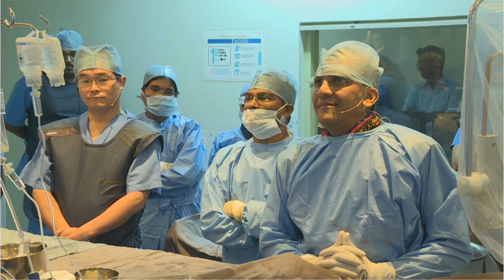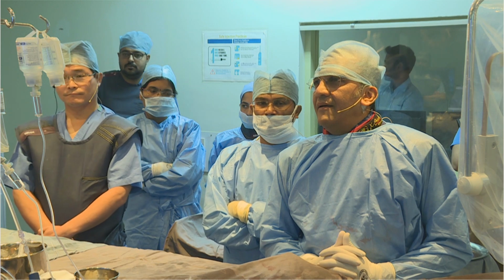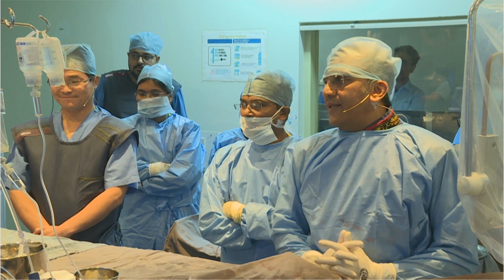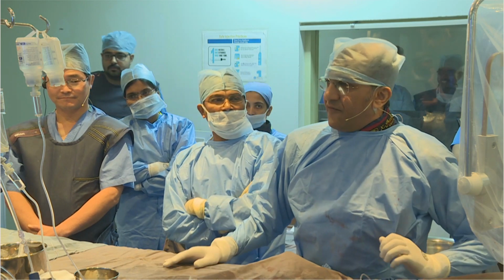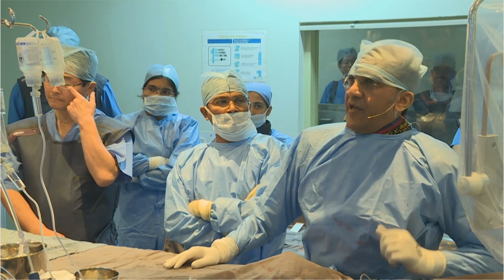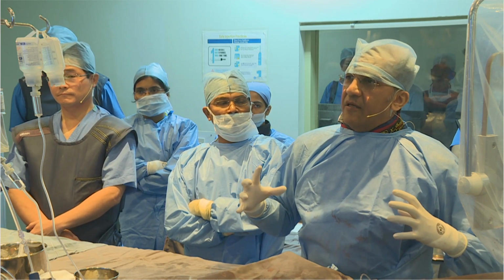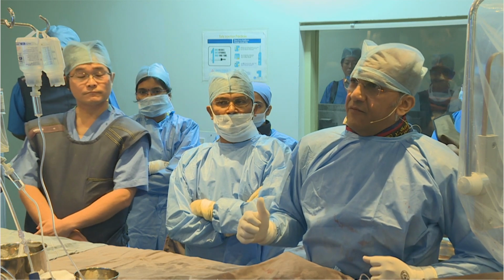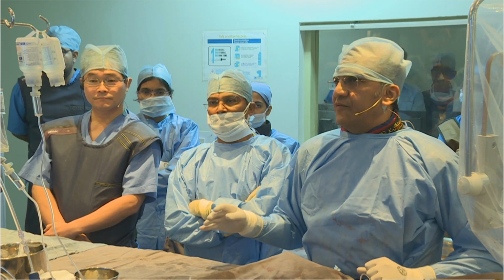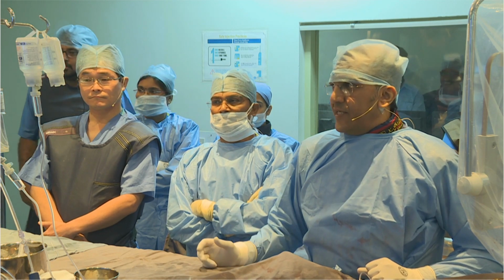So Kirti, tell us what you plan to do. Did you get the physiology in, or did you go for imaging first? I think what I would do in my own lab at home would be physiology first. Yeah. So that's what I did. We really wanted to understand the complexity or the scope of the problem. The first thing I started with was to go into the worst branch of the OM and take a physiological assessment of the circumflex artery.